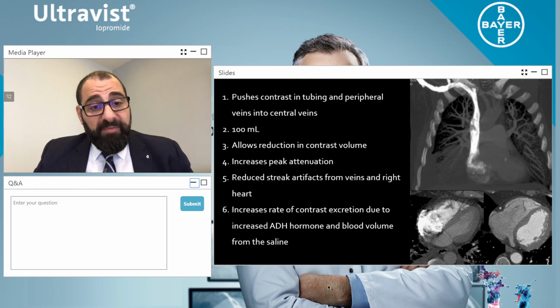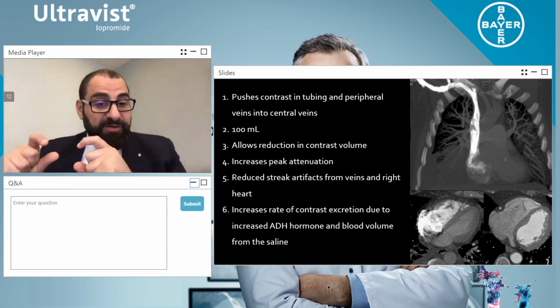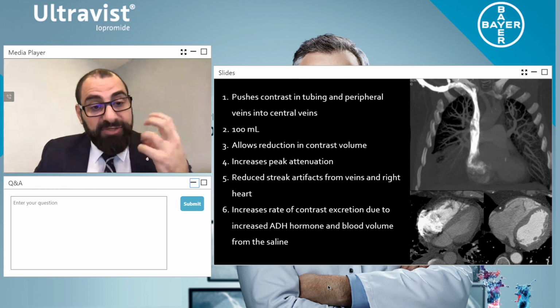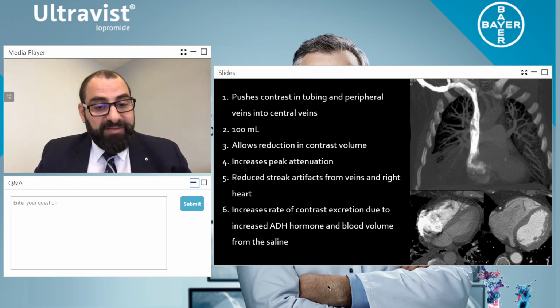If you're looking at a dimer, which is apparently meant to be the safest contrast in the market, which there is no actual documented evidence in literature, that's moving at like 14 to 16. So it's a lot slower, because the dimer is a double molecule, and so it moves a lot slower compared to the single molecule, which is the monomer. That allows the contrast to move a lot better. So that was a fantastic question.